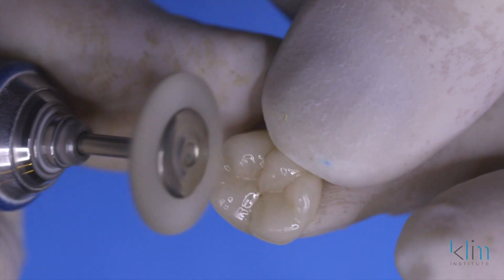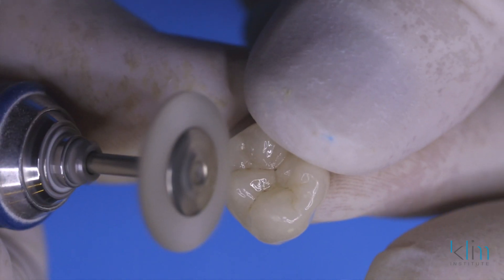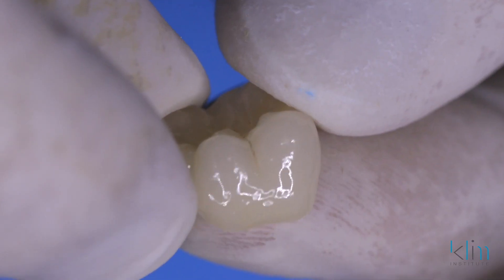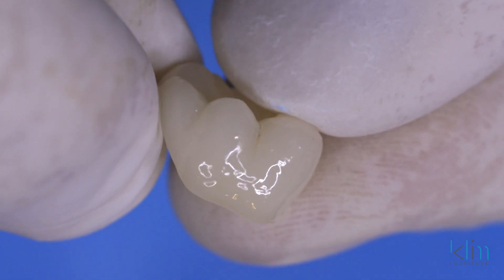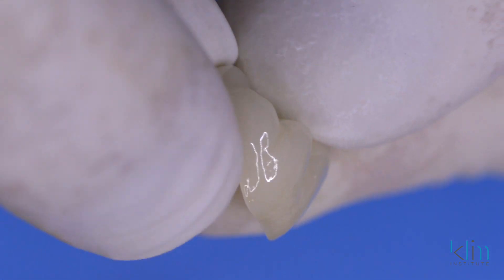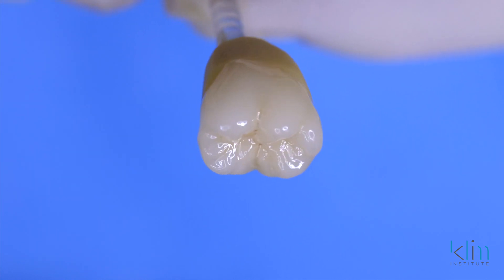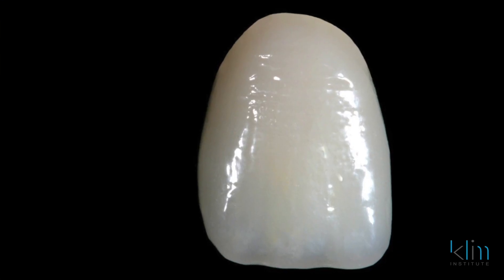When your restoration comes out of that furnace, it may look great, but microscopically it has roughness on it. We want to optimize that surface to the opposing dentition and we want to refine the margin area — polish it well to make sure there are no porcelain tags and that it's really smooth. So when you do cement, it's easy cleanup and it's a smooth surface that doesn't collect biofilms microscopically. That's why we superficial gloss finish all our restorations here at the Clem Practice — we want a good smooth area under the gum line and anteriorly we use it for superficial gloss finishing to really make our restoration sizzle.